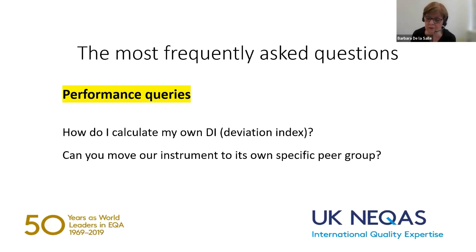an entire webinar to peer group assessment and grouping of instruments, particularly working on from work we've done over the last couple of years with one particular instrument manufacturer. We do, where possible and where it is necessary, group the participants into their own peer group. We don't do every single instrument. We try to group them into as small a number of peer groups as possible, which gives the best representation statistically.